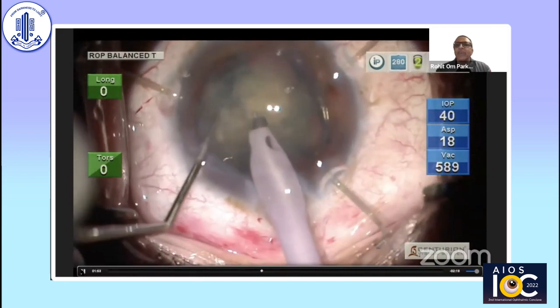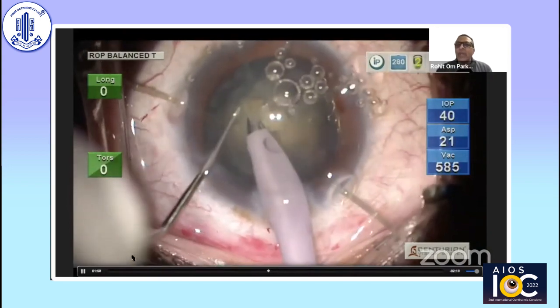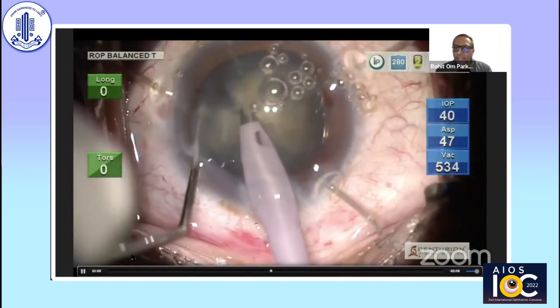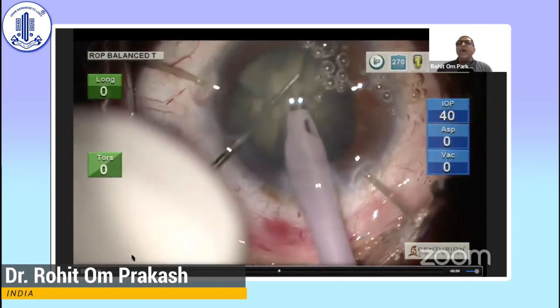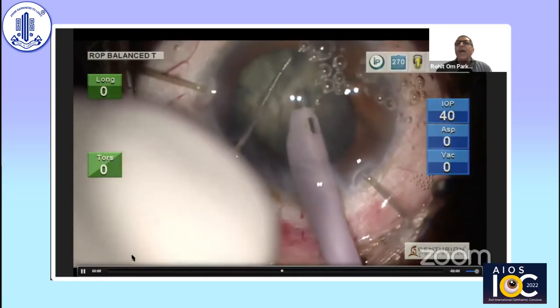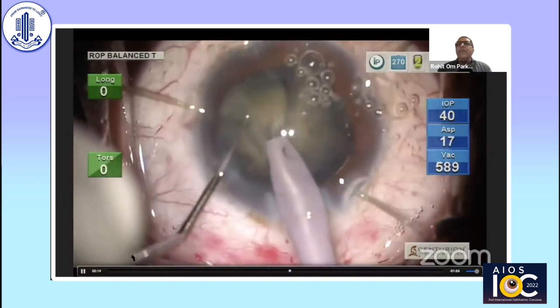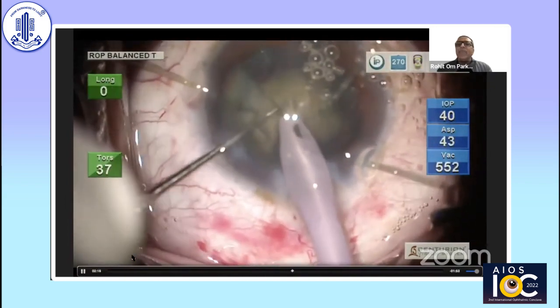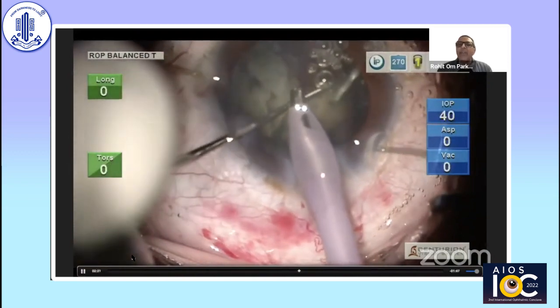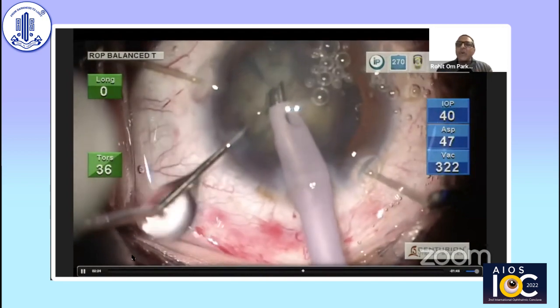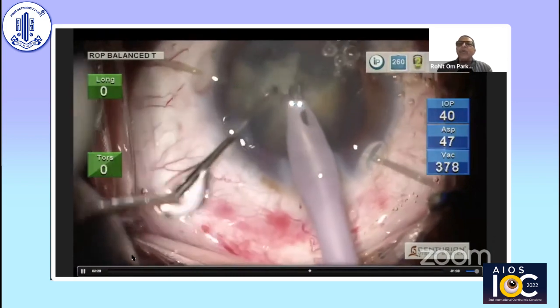I started with emulsification. In this patient I'm using 40 mmHg IOP pressure — this is a relatively old movie. In present circumstances I use around 28 mmHg for phacoemulsification, as that helps a lot. I've done cross chopping here, creating small nuclear fragments and separating them fully. Because of the artificial zonules in the form of capsular hooks, there was immobilization and I was able to rotate the nucleus.